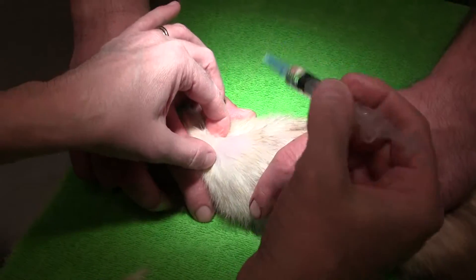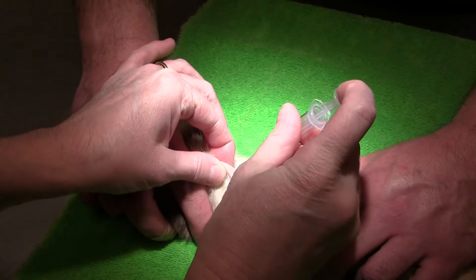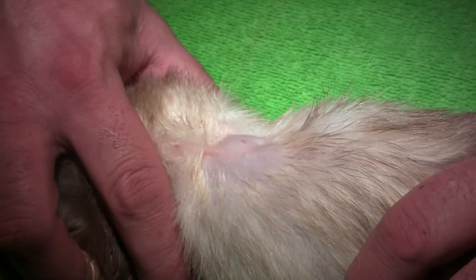I'm going to put in about half a cc of just some saline sub-Q. It helps make a little bubble so I can see where I'm going a little better. And she's eating ferritone to help distract her.